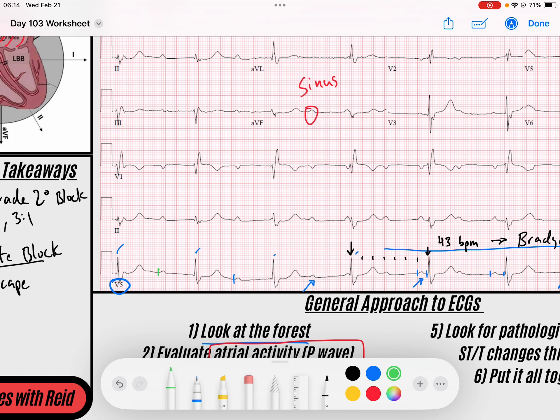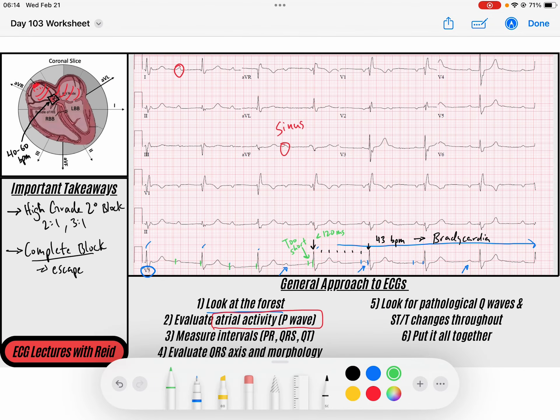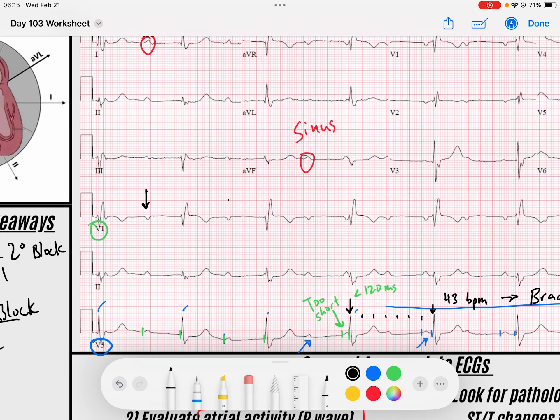My PR interval is changing every time - it seems to be longer, just as long, and then look at this one: this PR interval is too short, less than 120 milliseconds. When you see PR intervals that are too short, that makes you think the P waves are dissociated from the QRS complex - the atria are dissociated from the ventricles. That makes me think of a heart block. So I start to march my P waves. I'll come over to V1: I've got a P wave here, a P wave here, a P wave there, a P wave right before that QRS, a P wave there.